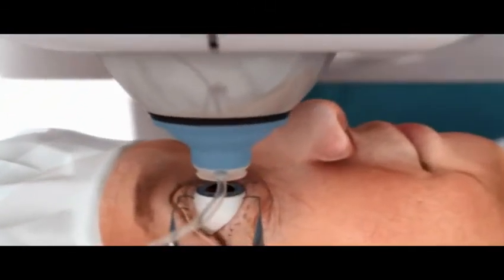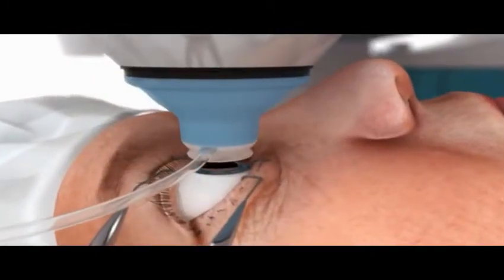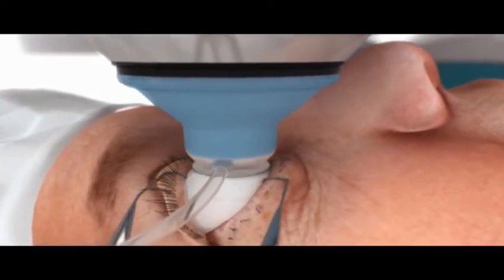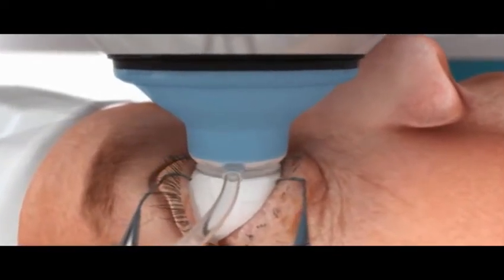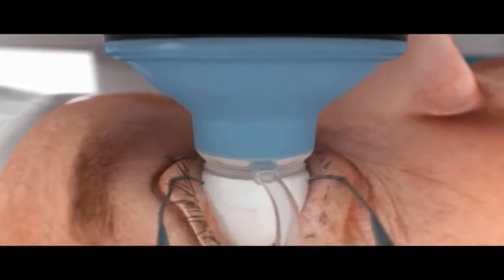And live OCT image to gently guide and dock the disposable patient interface to the corneal surface. The large-range OCT rapidly scans the entire anterior segment. This allows each step of the procedure to be easily planned, customized, and executed.